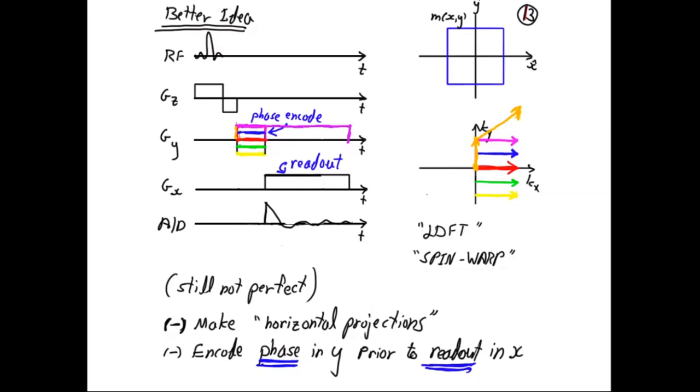Does that make sense? So if you do that, you fill k-space diagonally? Would you fill k-space? Well, I don't know. It depends what you do, right? If you actually extend the second one also, then in the second one you'll go up to here, and then collect this line, right? So it's going to be kind of like a fan-like acquisition. That's what's gonna happen, which is probably not ideal. It's very non-uniform.